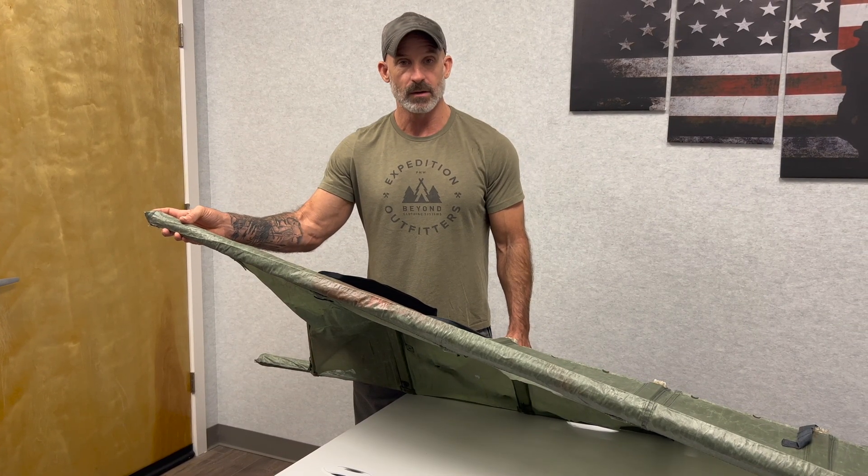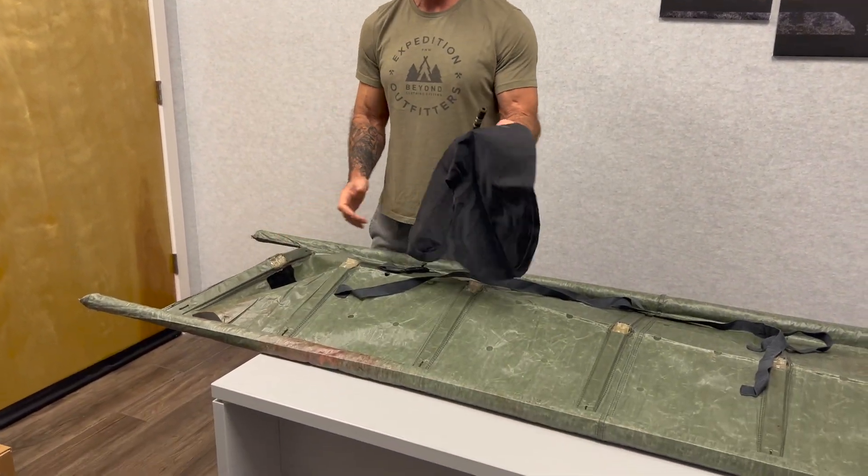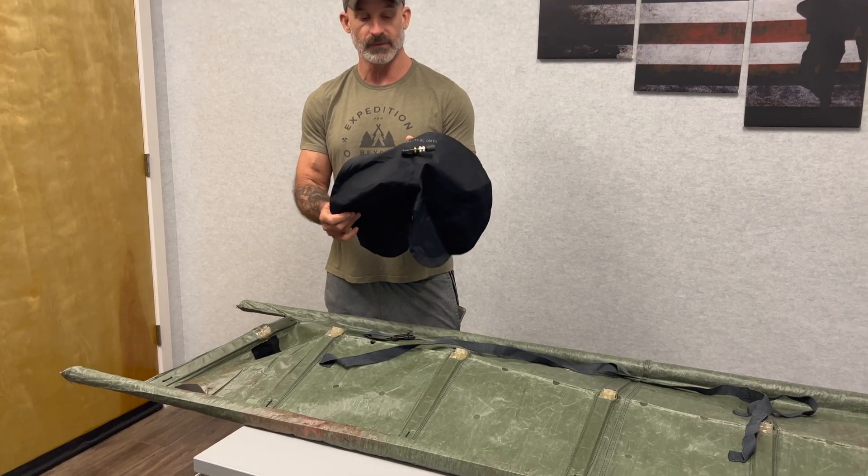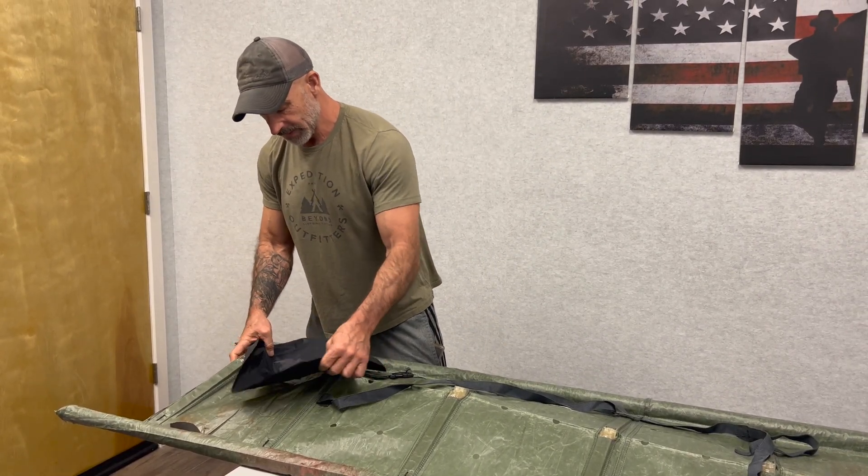Then you simply put the one-inch Kevlar webbing over the top. At the top we have a removable neck rest — it's inflatable, you can blow it up, and it closes down right here to keep your neck stable.